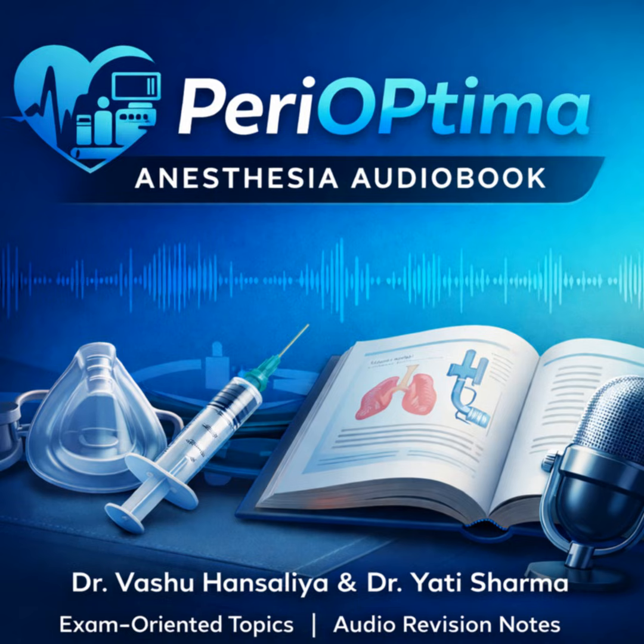The surface is roughened for a reason, to give you good traction during that critical lifting part of the procedure. It's also where the batteries are housed. And it's part of the electrical circuit. Right. When you engage the blade and open it up, you complete a circuit, and that illuminates the light source.